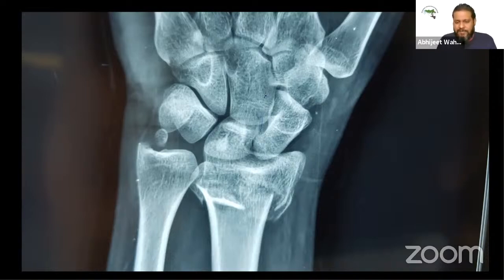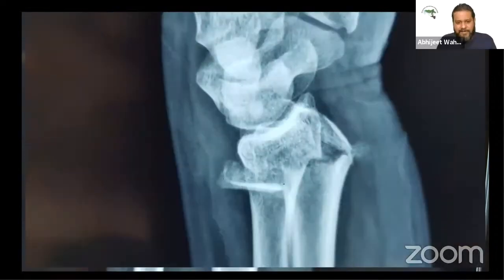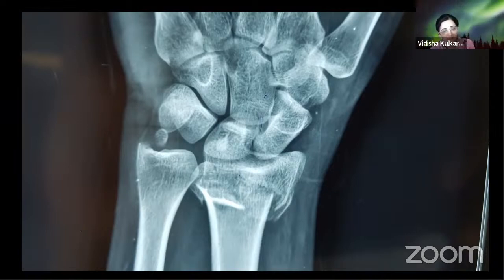So this is the PA view. Vidisha madam, would you like to comment, please? Or do you have any other views? Lateral view, traction? This is the lateral view, madam. Or CT scan? We'll come to that. But if you were to just look at these, what would be your primary view? There is definitely an ulnar styloid fracture with fracture of the ulnar corner, as well as a dorsal rim fracture. But I need additional views.